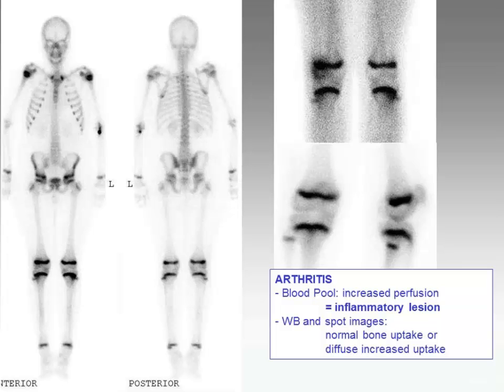Remember that we can have a diffuse increased uptake when we have hyperperfusion, but in this case it was not the case, and we have no abnormalities on the bone scan.